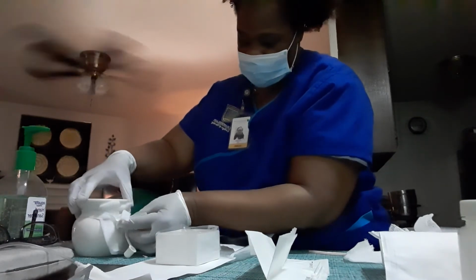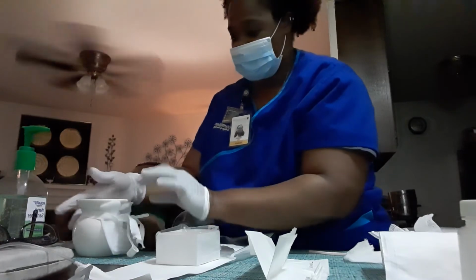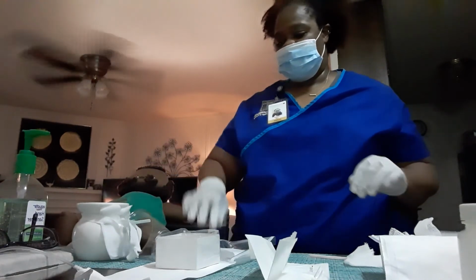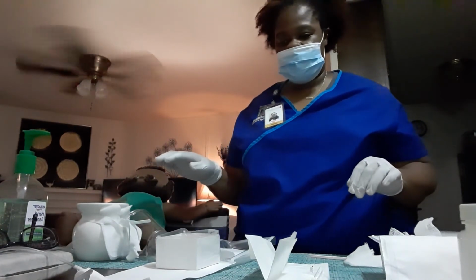Okay. And now my patient, the trach tie is secured. One finger breadth tightness. I'll put the oxygen mask back on.